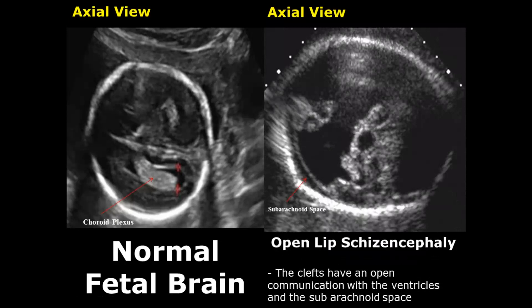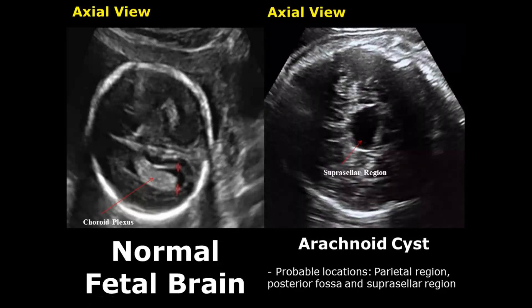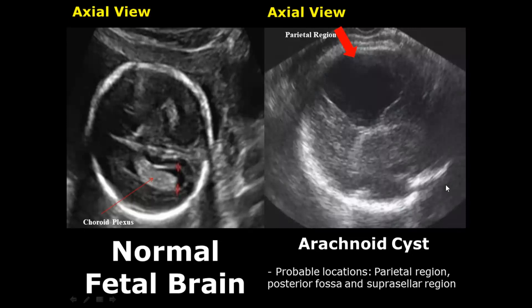In the open-lip type, the walls of the clefts have separation and there is direct connection from the lateral ventricle to the brain surface. An arachnoid cyst is present between the meninges of the brain — that is, in the subarachnoid space — and does not connect with the lateral ventricles. The most common location is the parietal region, but it can also be present in the posterior fossa or suprasellar region. This is an arachnoid cyst in the parietal region.